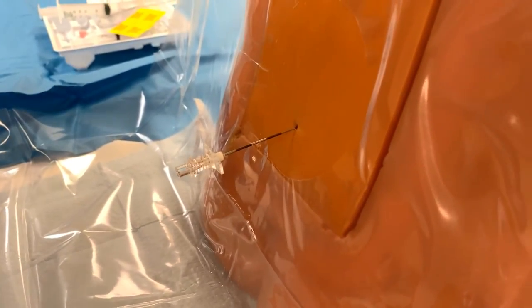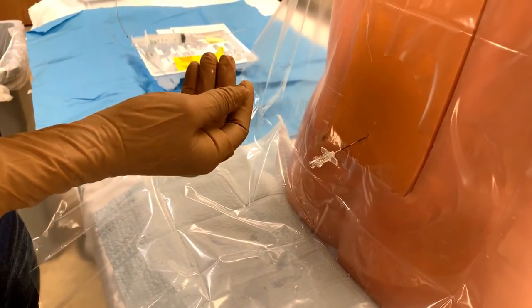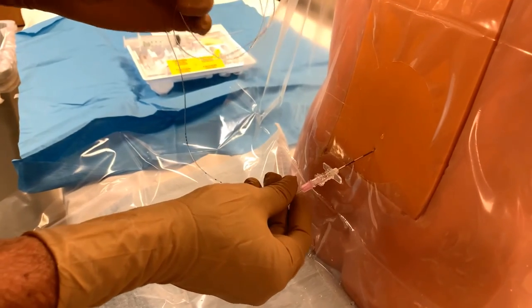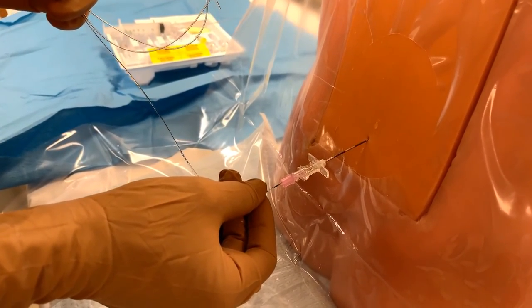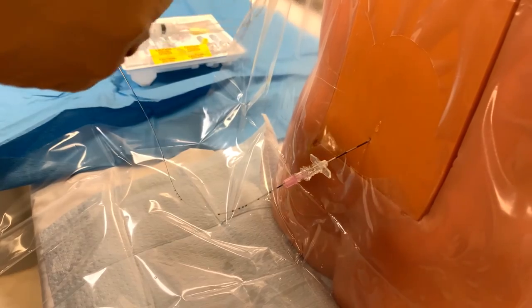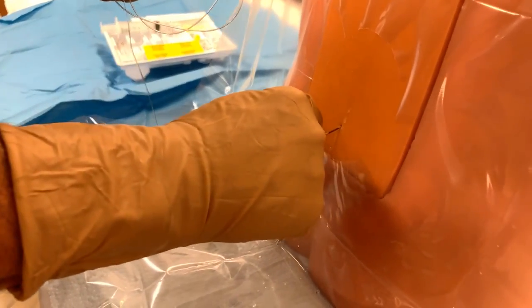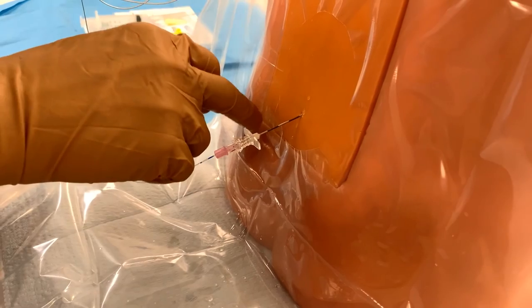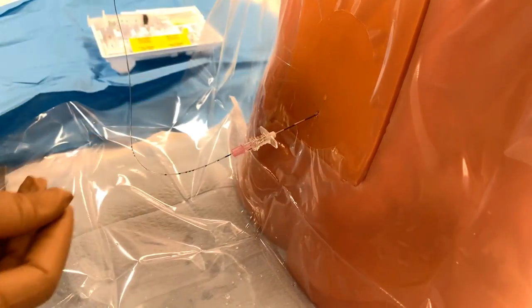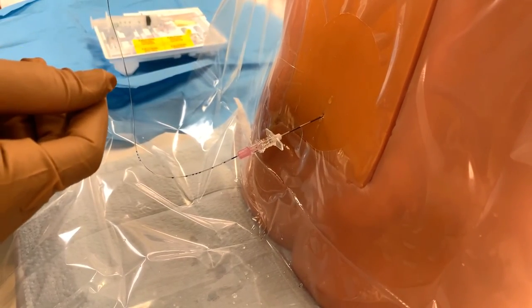This looks good — we're now ready to thread the catheter. Hold it so that it's angled upward, place the introducer catheter, and advance until you're at the solid mark, indicating the catheter is now at the tip of the needle. We want three to five centimeters of catheter in the epidural space. The needle itself is nine centimeters long; we have roughly four and a half centimeters showing, so we're approximately four and a half centimeters to the epidural space.